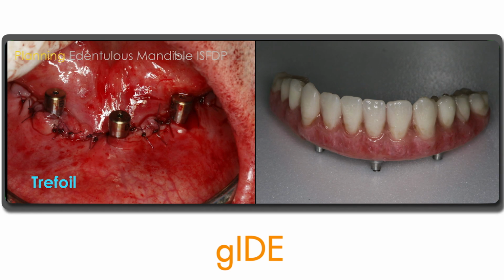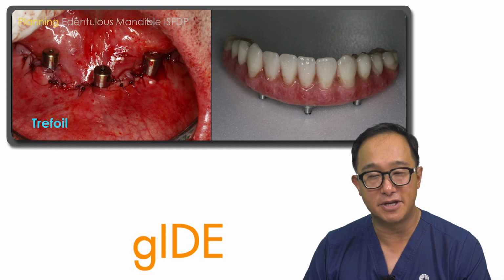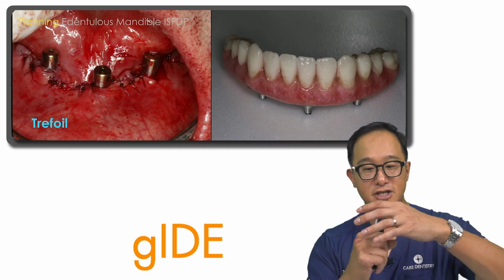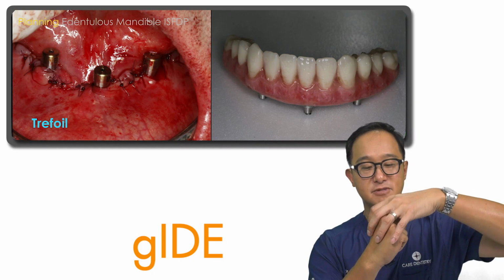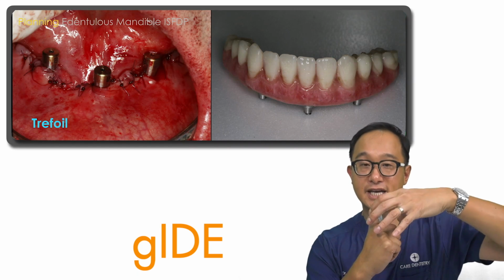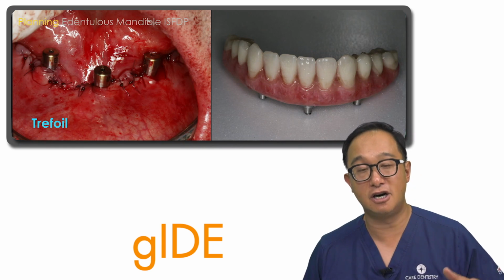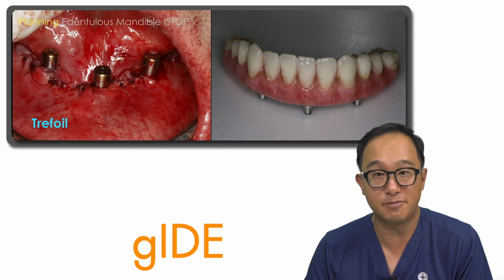So this bar is not a milled bar, this is once again a prefabricated bar, but they have a unique ball and socket type fitting abutment system. So it's a bit like a ball that allows the bar to fit correctly that gets laser welded. So that's how they got around some of the problems of the misfit of the historical Novum type approach.